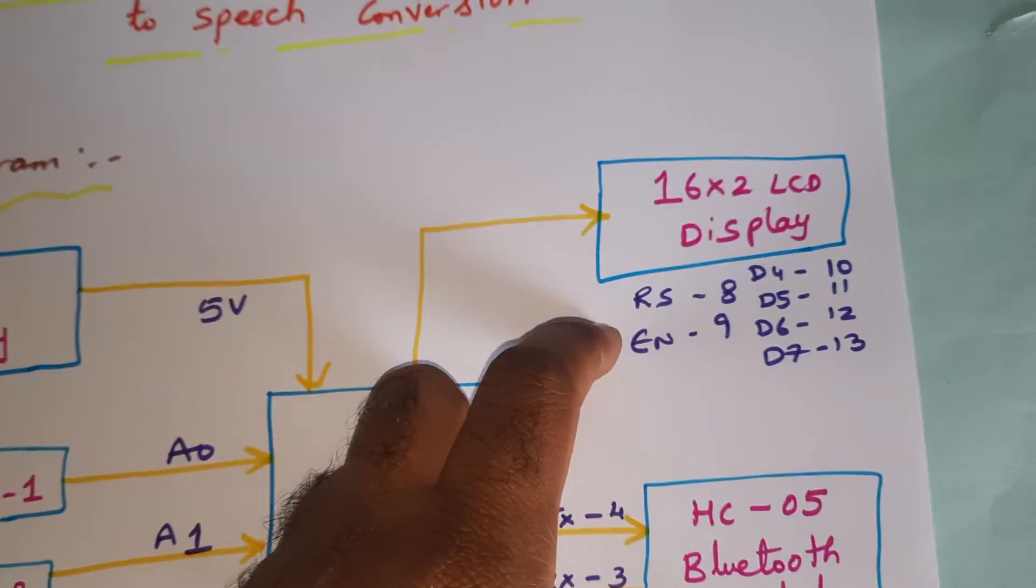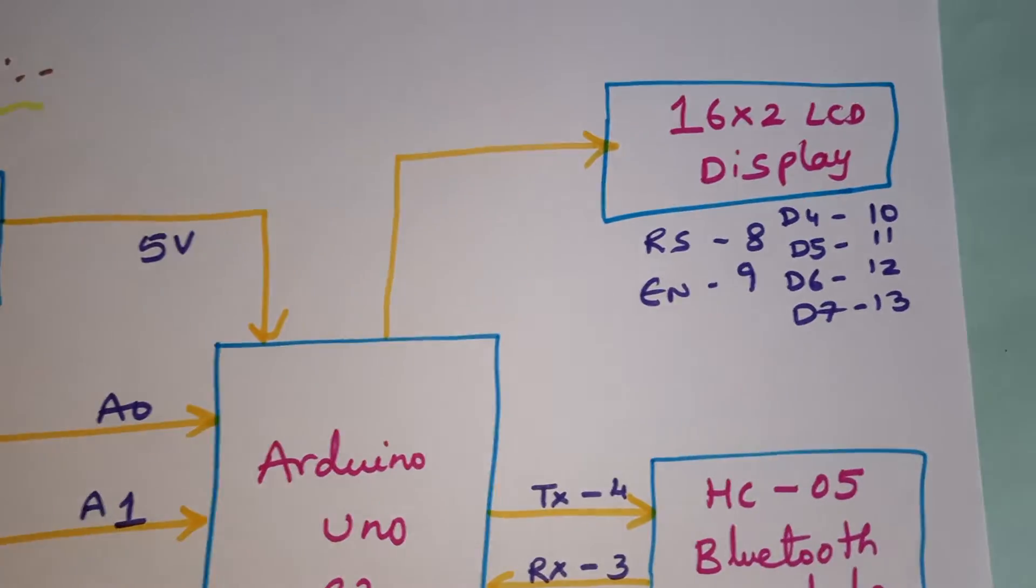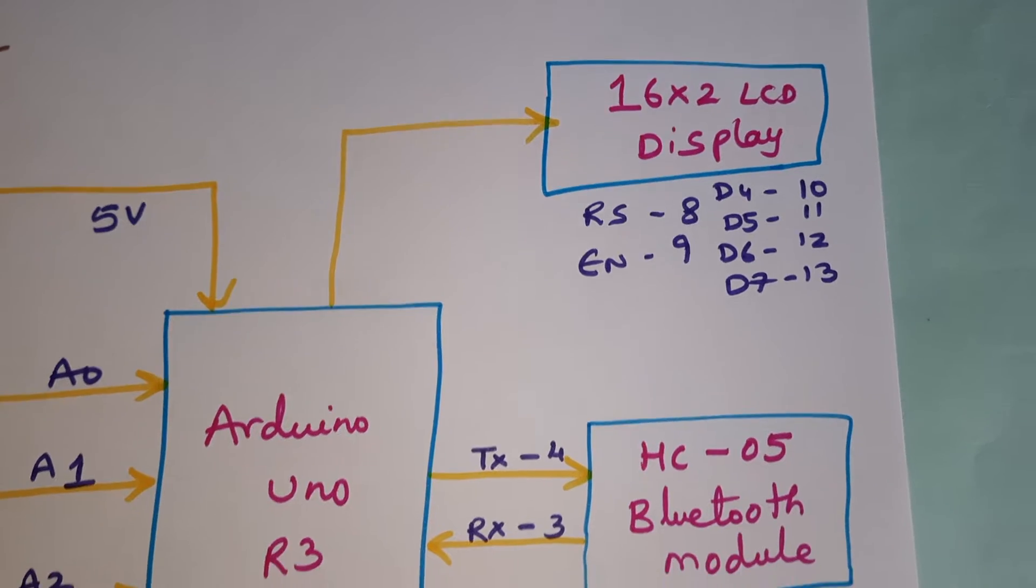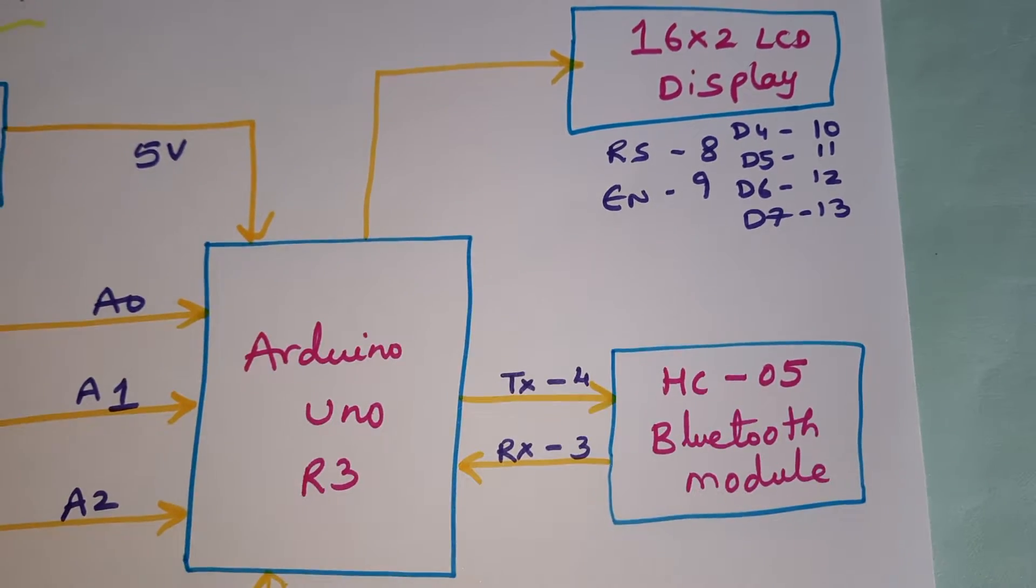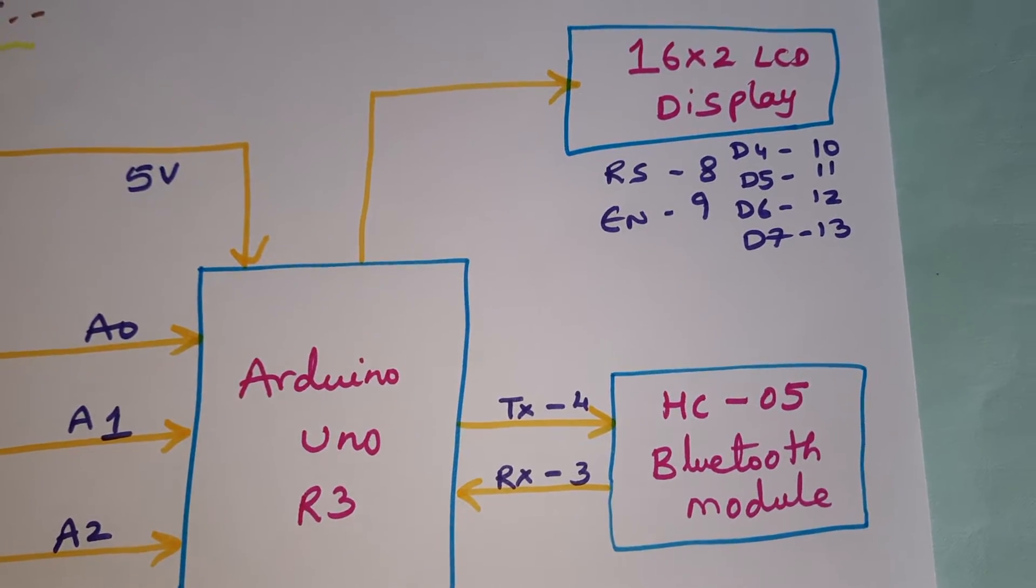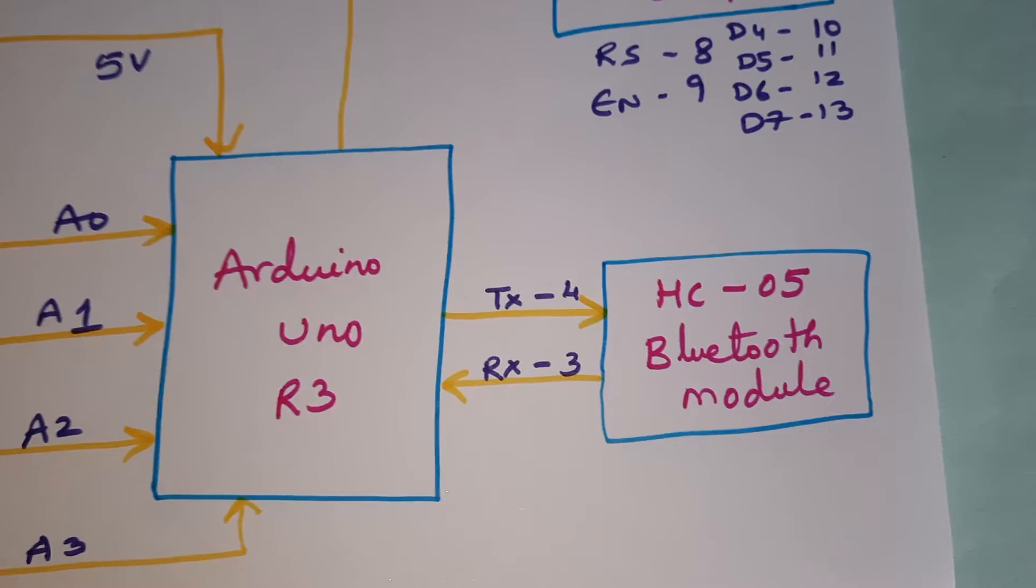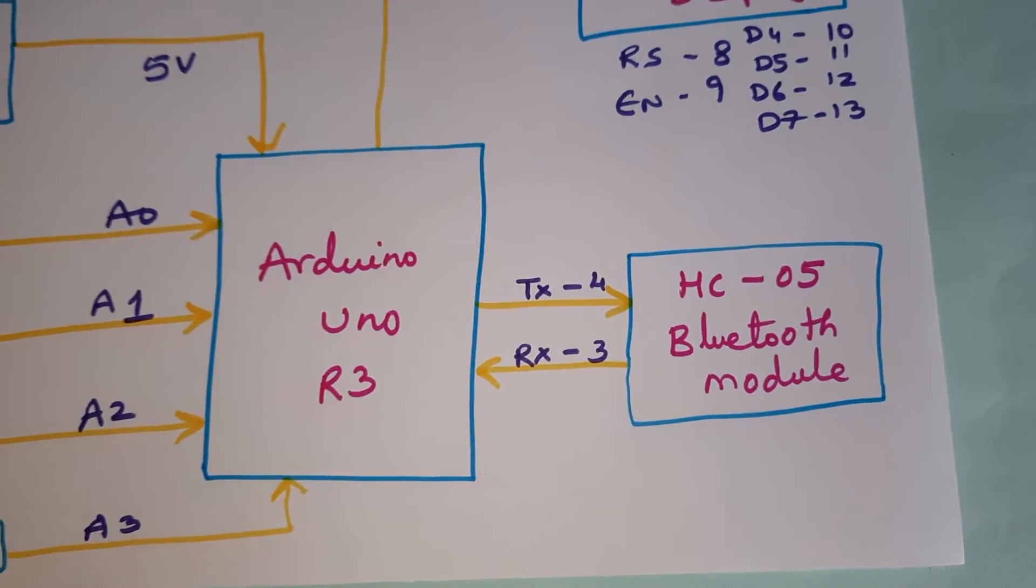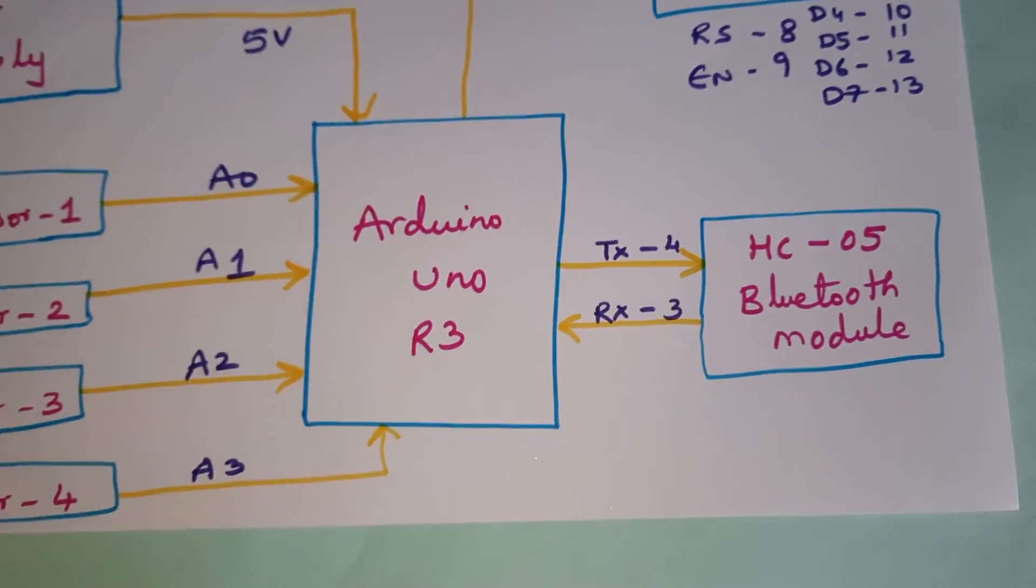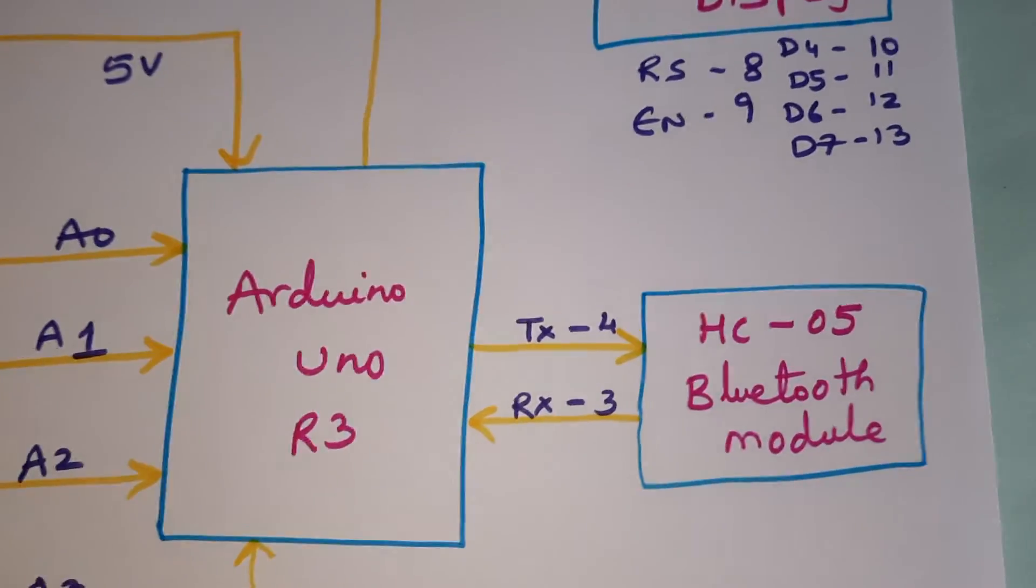Here, 16 by 2 LCD display is connected with RS, Enable, D4, D5, D6, D7 - pins 8, 9, 10, 11, 12, 13. HC-05 Bluetooth module is connected to TX and RX, those are connected with 3 and 4.